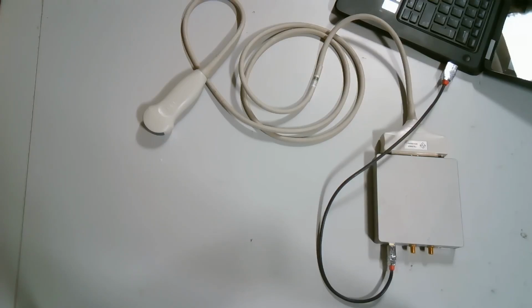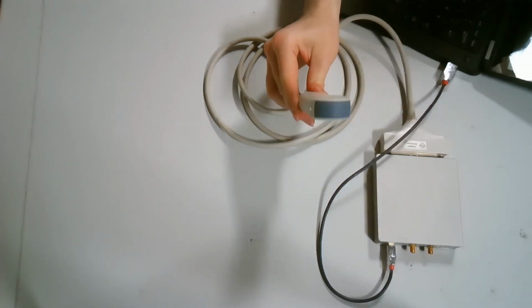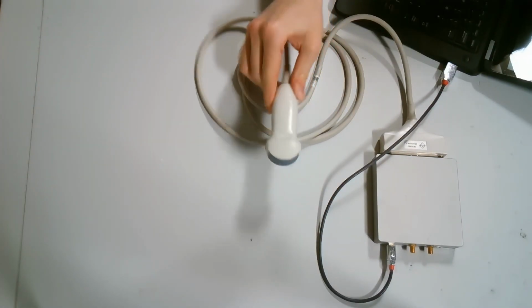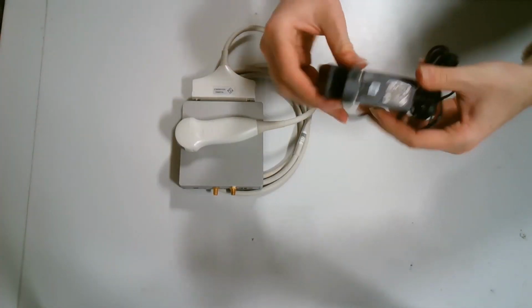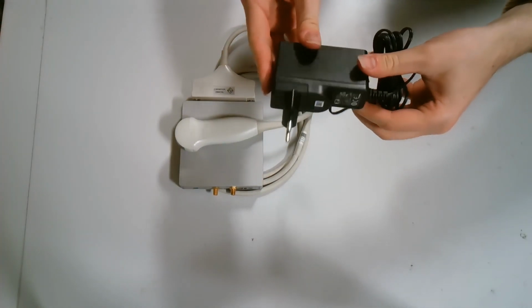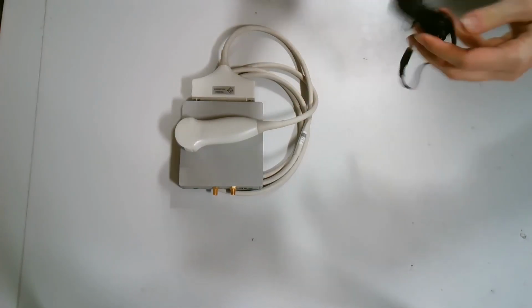Your ultrasound system receives electrical power from your computer. If you have connected your ultrasound system to a USB hub, it might not have enough power. You can connect your ultrasound system to electrical power using the electrical power plug.